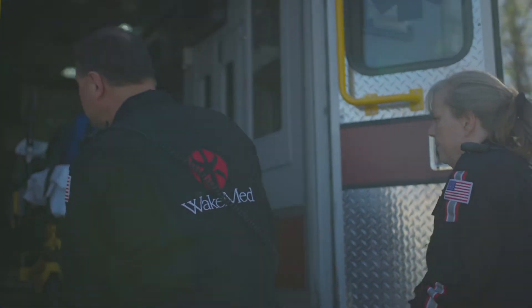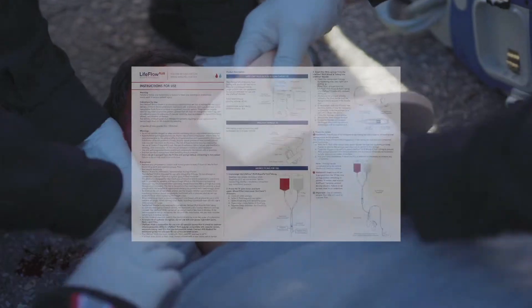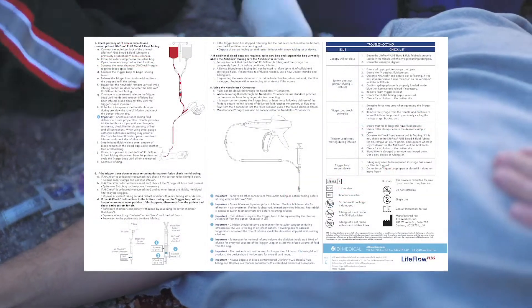This video is designed to show the setup and use of LifeFlow Plus in real time. Please refer to the IFU for full use instructions, indications, and warnings.